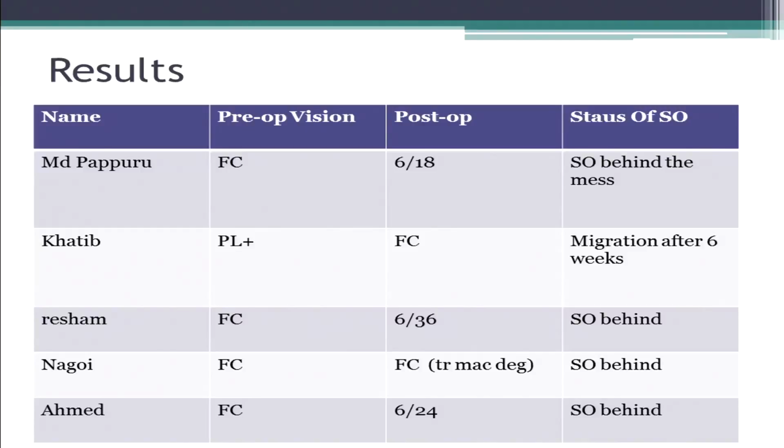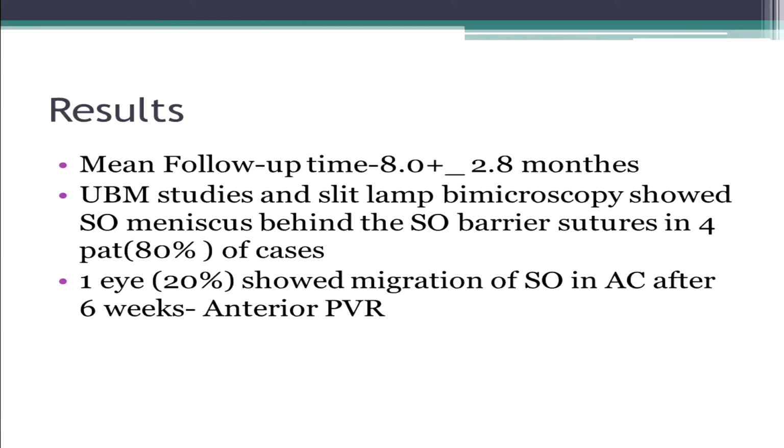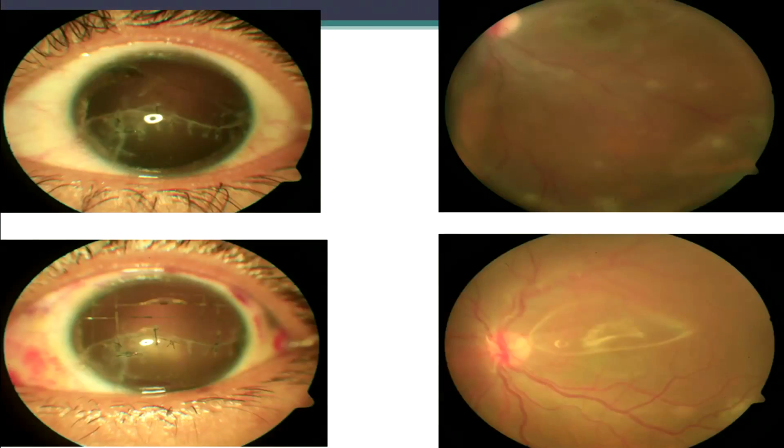In all 5 patients, in 4 patients, silicone oil remained behind the mesh. In one of the patients, migration of the silicone oil happened after 6 weeks of the surgery. So in 80% of the patients the silicone oil remained behind the Prolene mesh, and in 20% it migrated into the anterior chamber. Mean follow-up time was 8 plus or minus 2.8 months. UBM study and slit lamp biomicroscopy showed a silicone oil meniscus behind the silicone oil barrier sutures in 4 patients, that is 80% of cases. One eye showed migration of silicone oil into the AC after 6 weeks. That is because of anterior PVR.